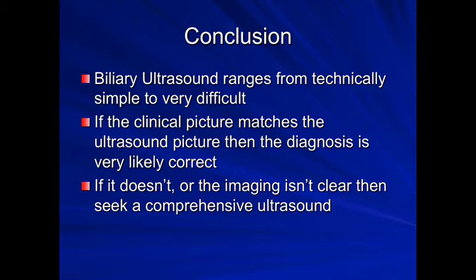But if the clinical picture doesn't match the ultrasound image, or if you can't get the imaging you require to make a confident diagnosis, then you should seek further assistance and get someone with more experience, or arrange a comprehensive ultrasound, or arrange other imaging as required.